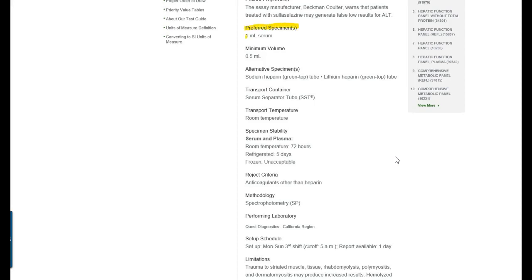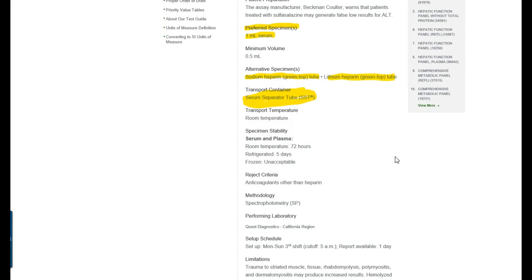So this is how you look for the tube color. The tube colors are actually listed here. The preferred specimen is always where what you want to go for for tube color. So it tells you that the preferred specimen is one ml of serum which means that you can use either a red tube which produces serum or an SST tube which is noted here. So if you draw in an SST tube you can just leave it in this SST tube which is what it says here you can transport in an SST tube. If you don't have any red or SST tubes available to you, you can also draw it in a sodium heparin green top tube or in a lithium heparin green top tube.